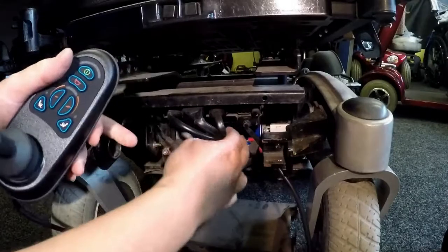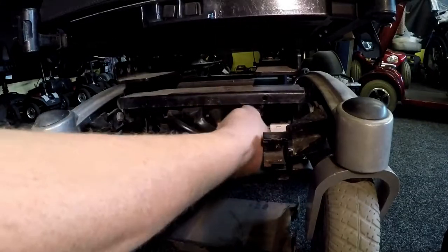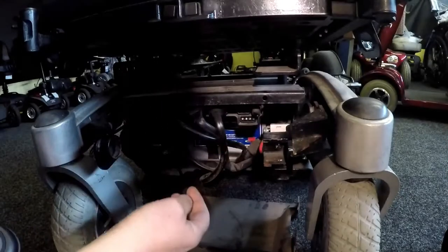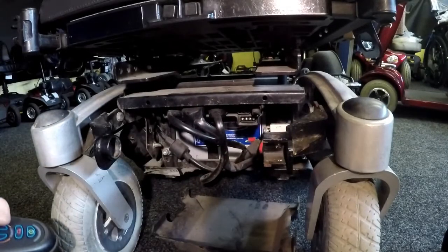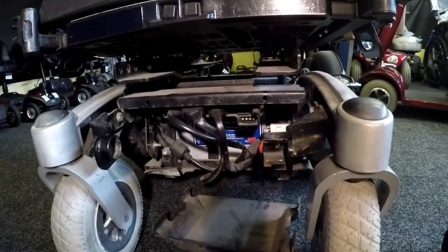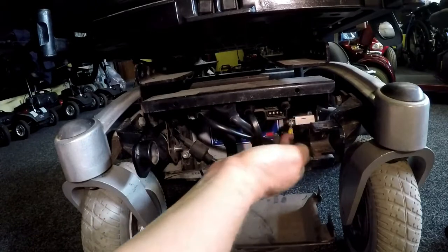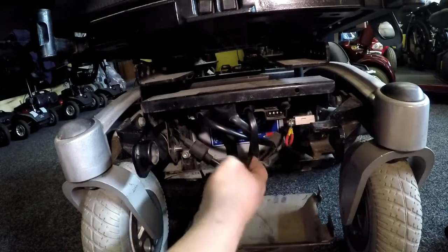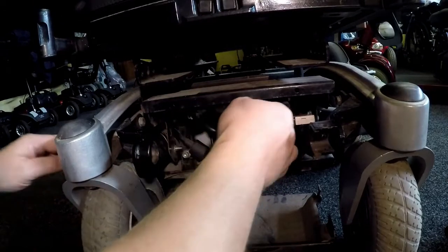Next thing, we know there's voltage coming here. We know that we've checked this cable here. Is it the power module? There's something wrong in the power module because we're not getting power. We're not switching on. It's a brand new box. So now that I've found there's a problem with the power module, I've got to remove the left hand motor, right hand motor, power supply.